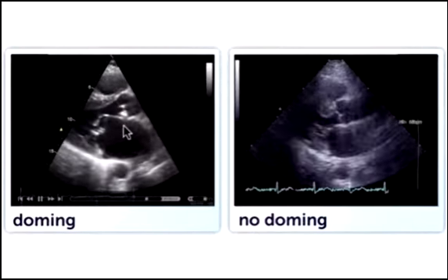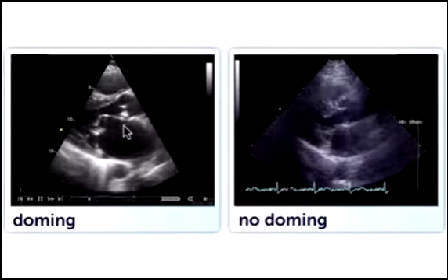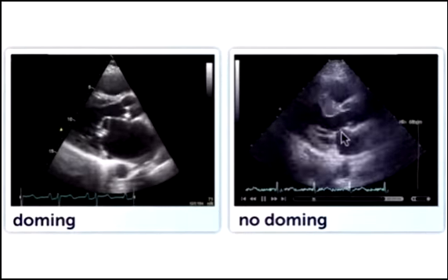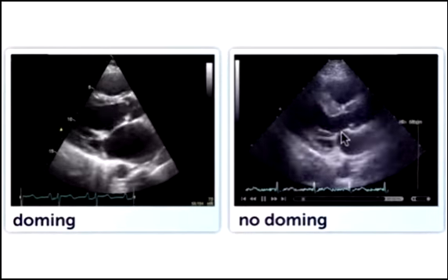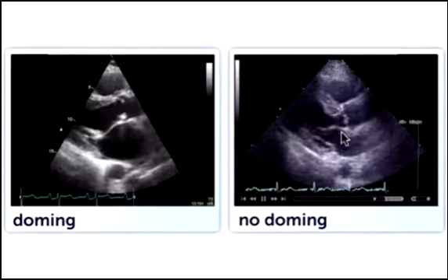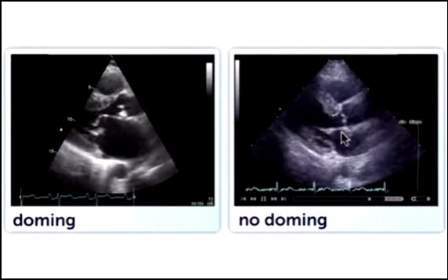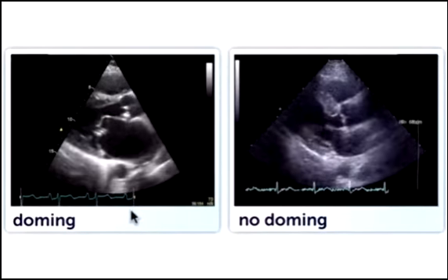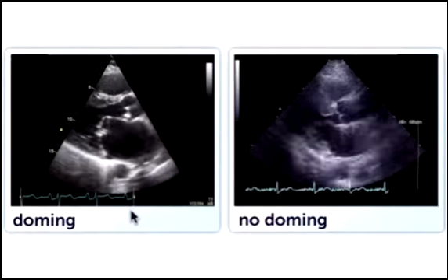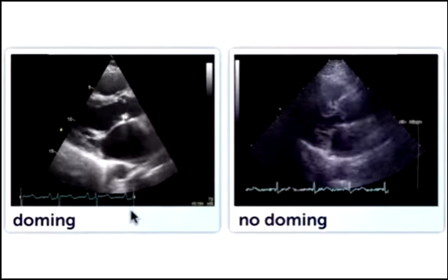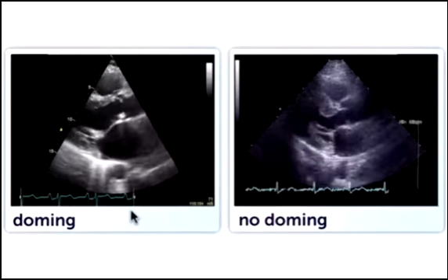A bulging motion of the anterior leaflet while the leaflet opens completely normal here in this normal patient. Remember, you can best see the doming motion in a parasternal long axis view.